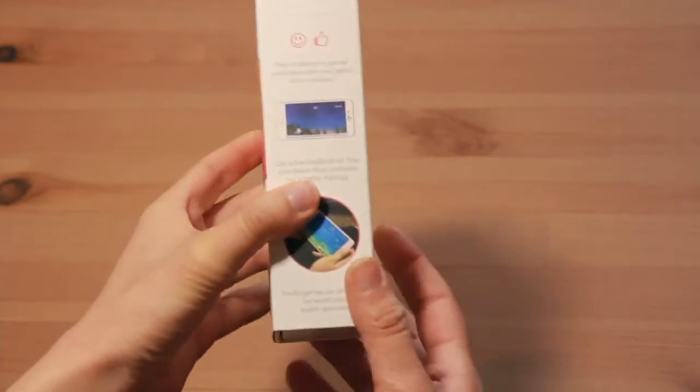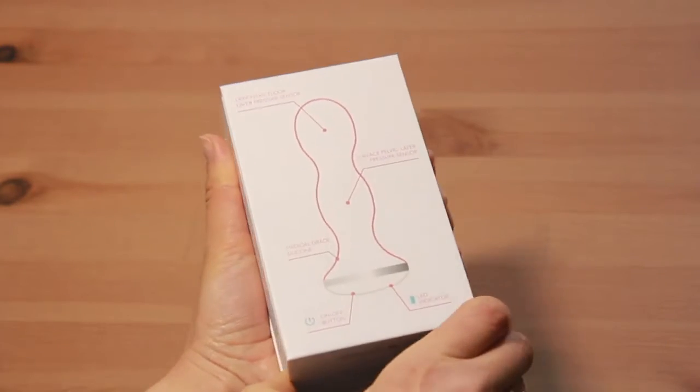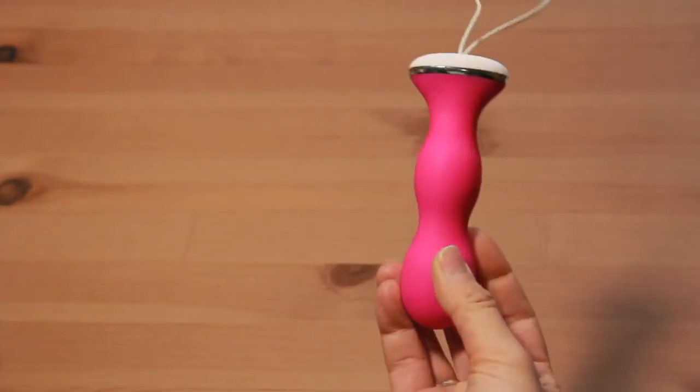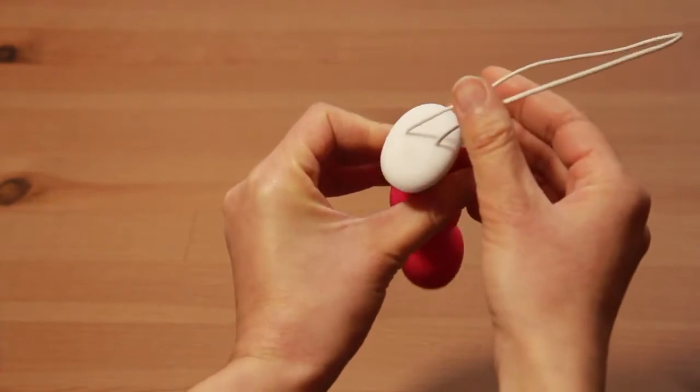This is the packaging of Parafeet. Each Parafeet includes two pelvic floor contraction sensors, one in each ball, to help you strengthen your perineum while getting fast and permanent results. The white part has a button and an LED, which shows when the Parafeet is switched on.